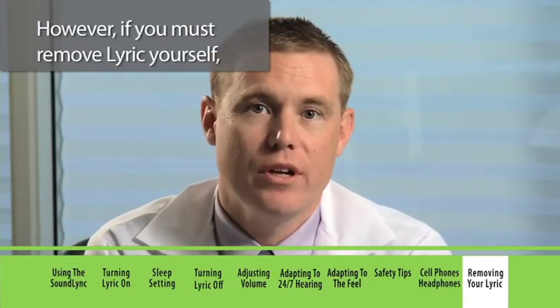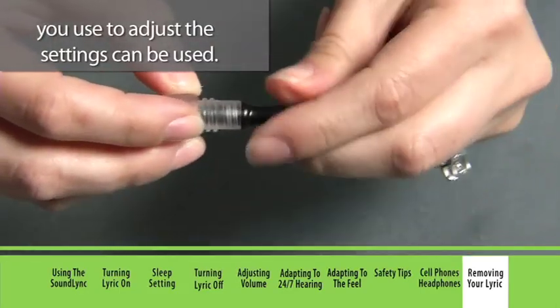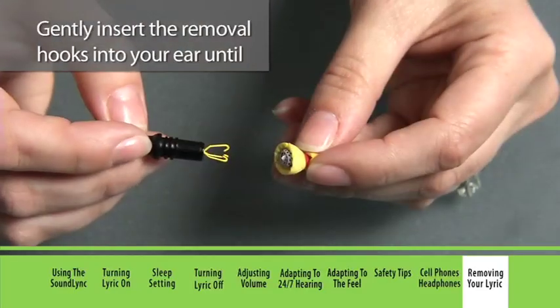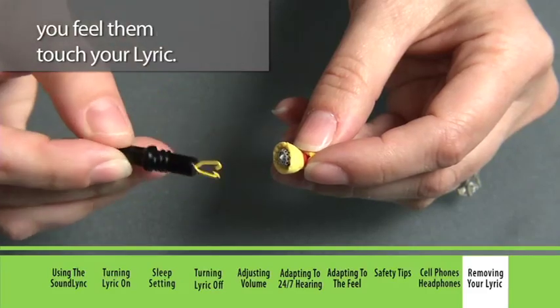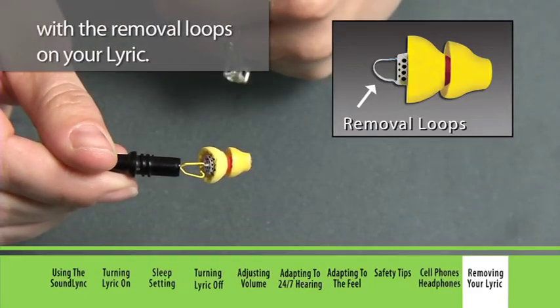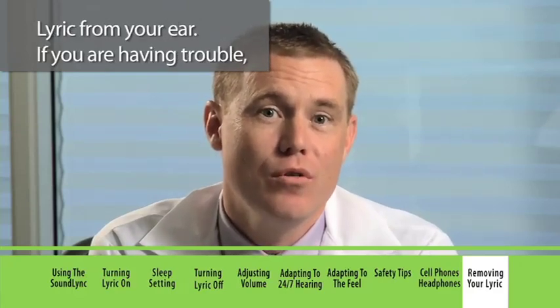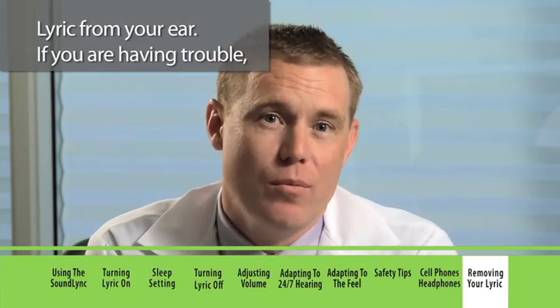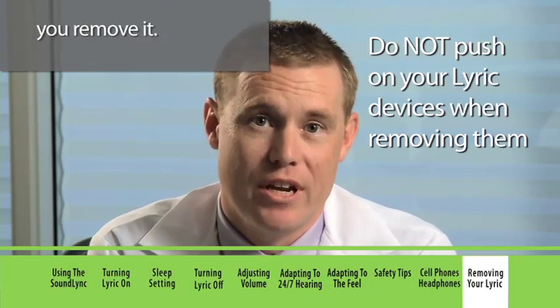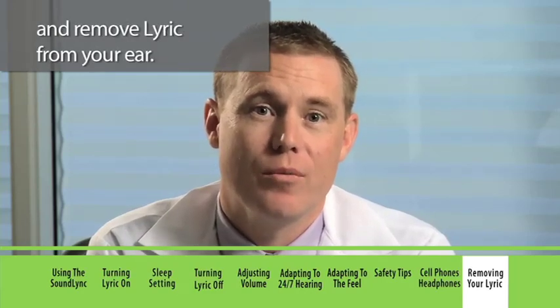However, if you must remove Lyric yourself, the same SoundLink adjustment tool you use to adjust the settings can be used. Simply unscrew the top portion of the SoundLink to access the small removal hooks. Gently insert the removal hooks into your ear until you feel them touch your Lyric. Twist gently until you feel the removal hooks engage with the removal loops in your Lyric. Then, using a circular motion, gently remove Lyric from your ear. If you're having trouble, ask a friend or family member to help. Do not push your Lyric when you remove it.